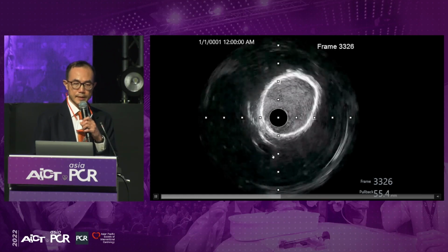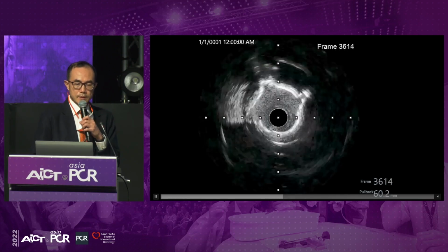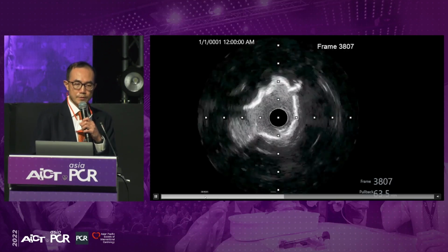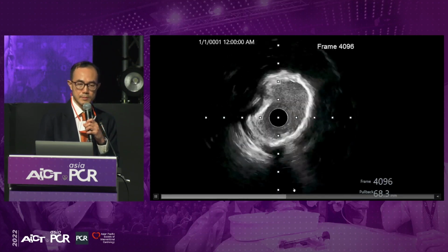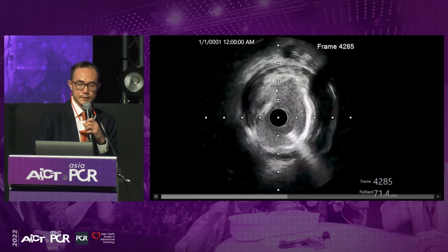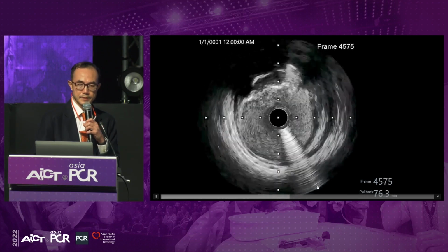So you can see that proximally there's still very extensive calcification, although in some areas you actually have fragmentation. You can see this is a very nice trifoil fracture from the 3 blades in the Wolverine balloon. There is another lesion there. We're coming back now into the left main.